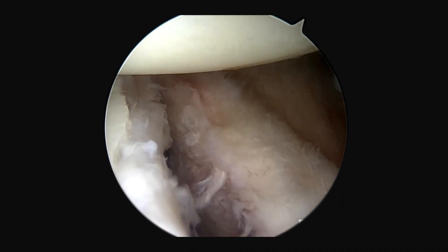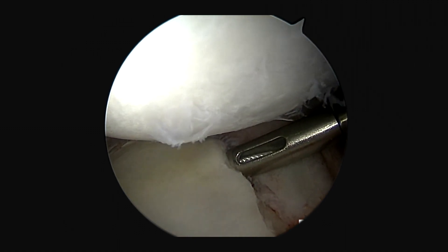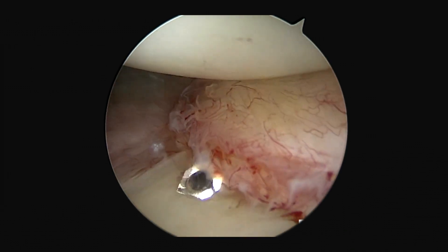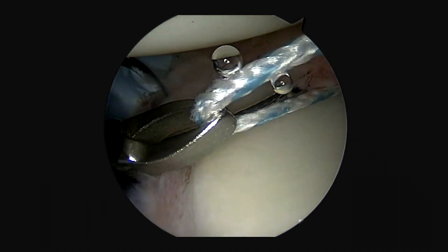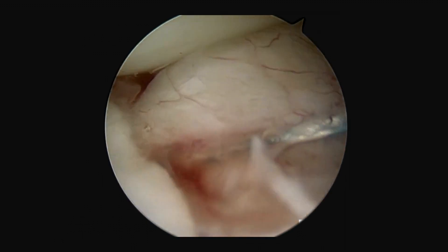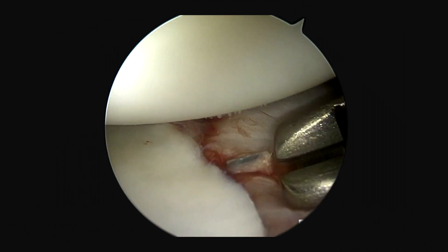I'll then proceed to my Bankart repair. You can see the lesion which we've prepped. I'm going to use knotless fiber-tacks to perform the repair, placing three 1.8 millimeter knotless fiber-tack anchors. We really like these anchors because we can get nice tension of the labrum, and with the knotless design, we can get as low as we need to reestablish the labral bumper. I pull the repair stitch posteriorly after shuttling through and bring it down into the knotless mechanism. Here you can see that labrum pulled up nicely to the glenoid rim.